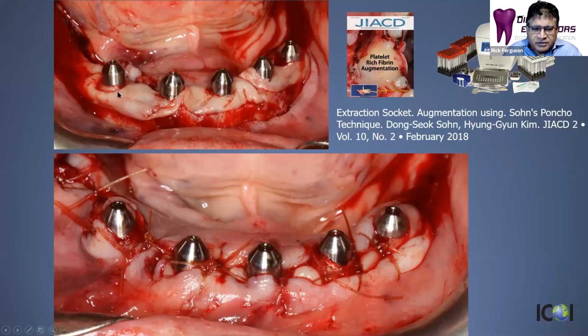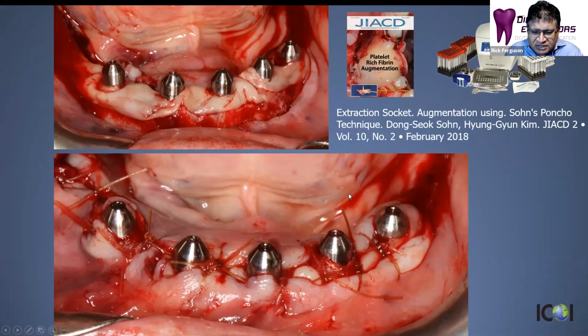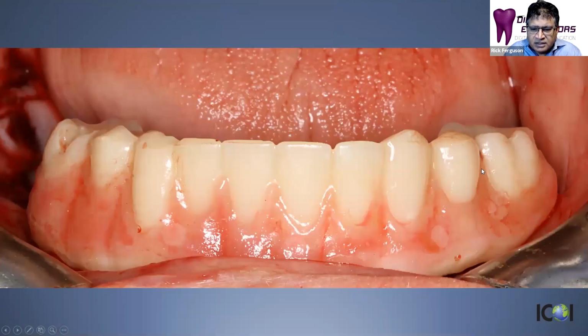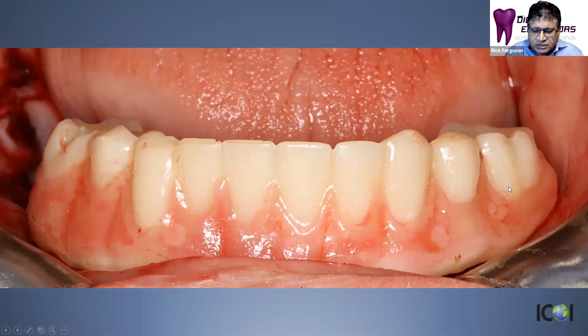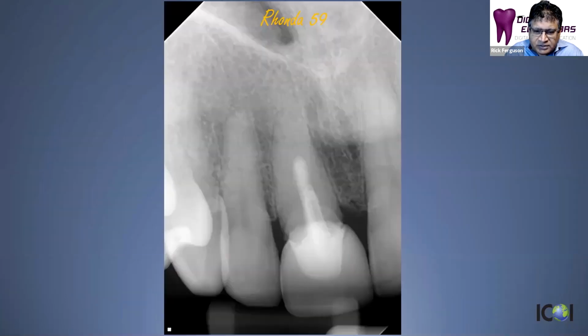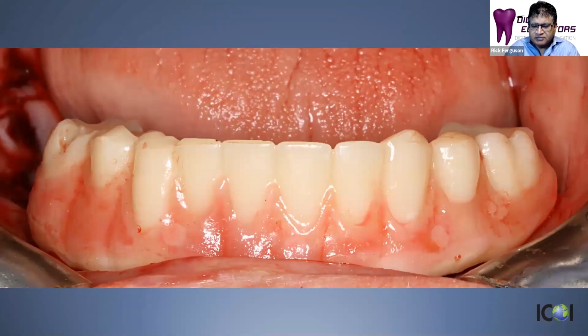So a very staged approach of, we have this protocol in place that we do the same thing sort of every time, which makes it very efficient in our practice. And then the last step is to take off the multi-unit caps, which we put in place for the suturing, and then screw the temporary hybrid in place. And this is how the patient goes home with the temporary hybrid. And very straightforward surgery, very efficient, because again, everything is planned out ahead of time. There's not much as far as guesswork to be accomplished, chair time.